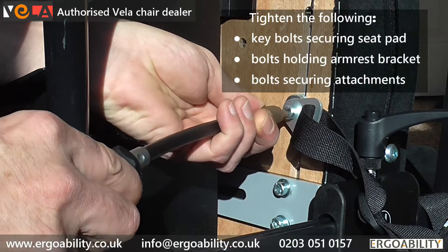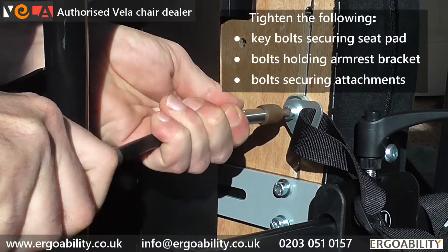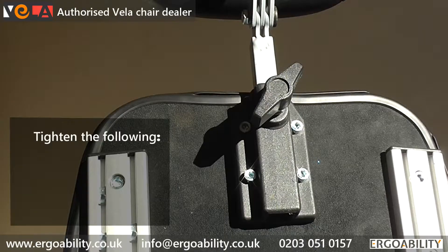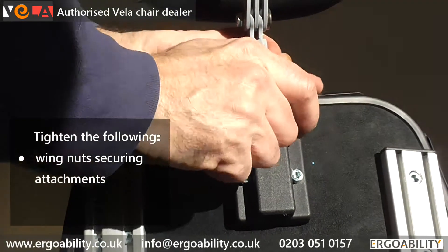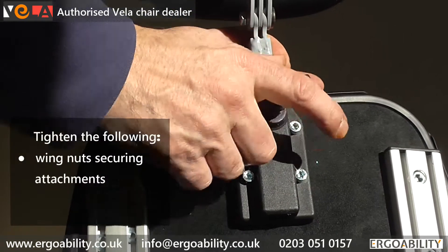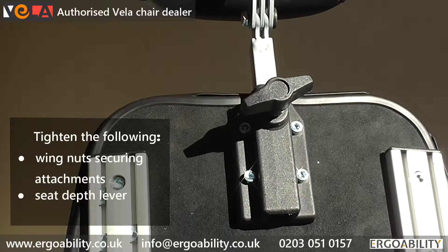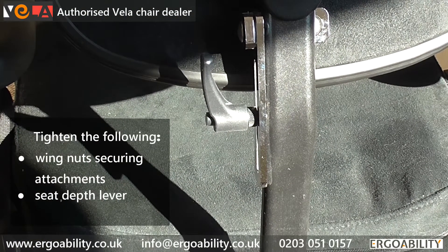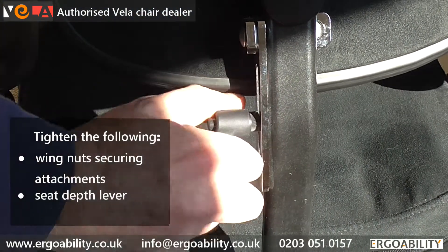Check that any attachments such as seatbelts, neckrests and footrests are fastened well. Also ensure that the backrest height and depth adjustment levers are tightened.